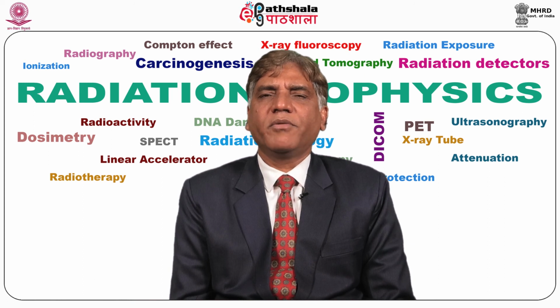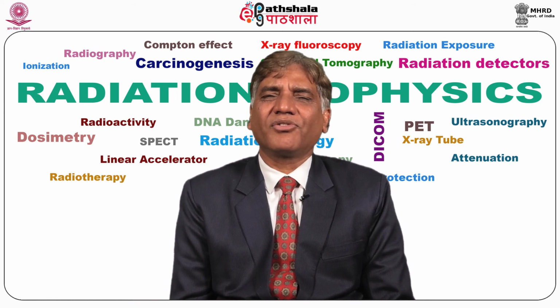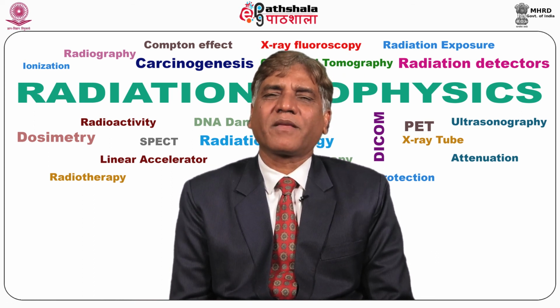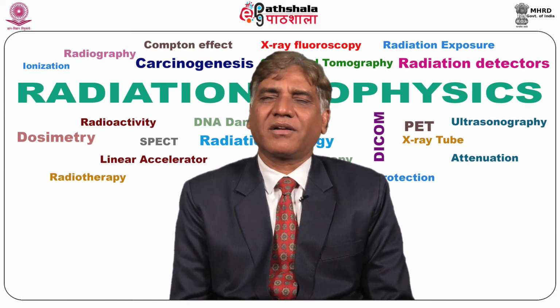When the ultrasound beam passes through the patient body, it gets attenuated, its intensity is reduced. This process is known as attenuation. This attenuation is occurring due to reflection, refraction, scattering and, of course, absorption. So absorption, reflection and refraction cause the attenuation itself in the ultrasound beam.